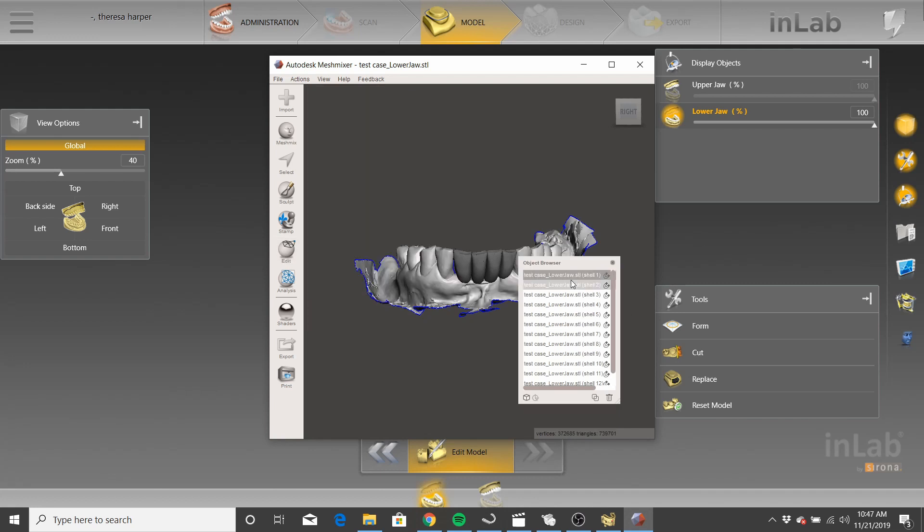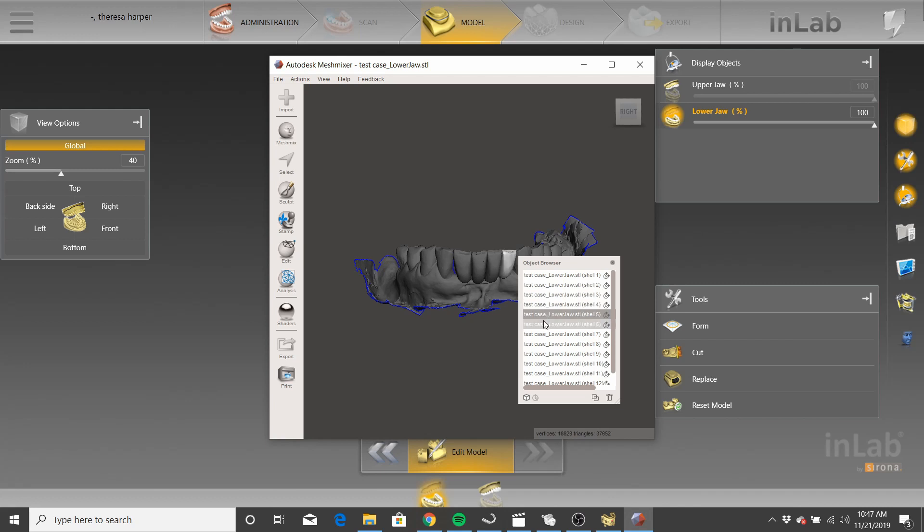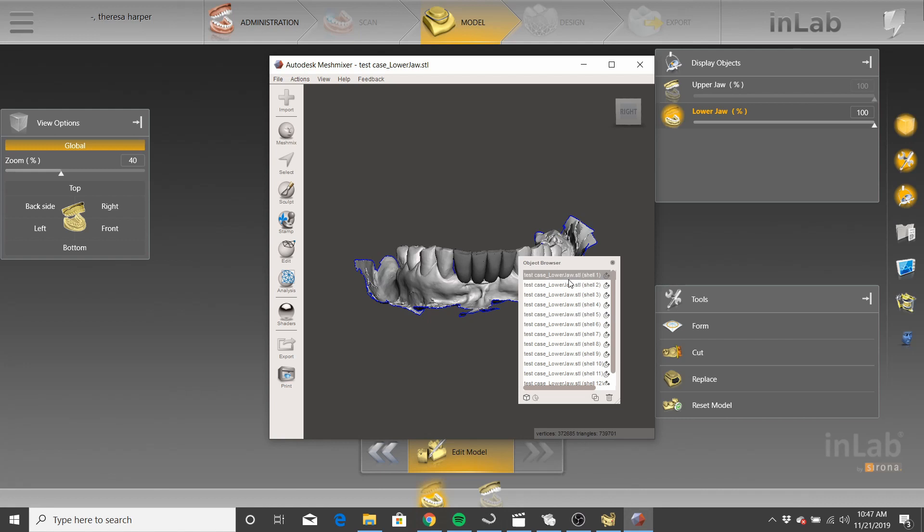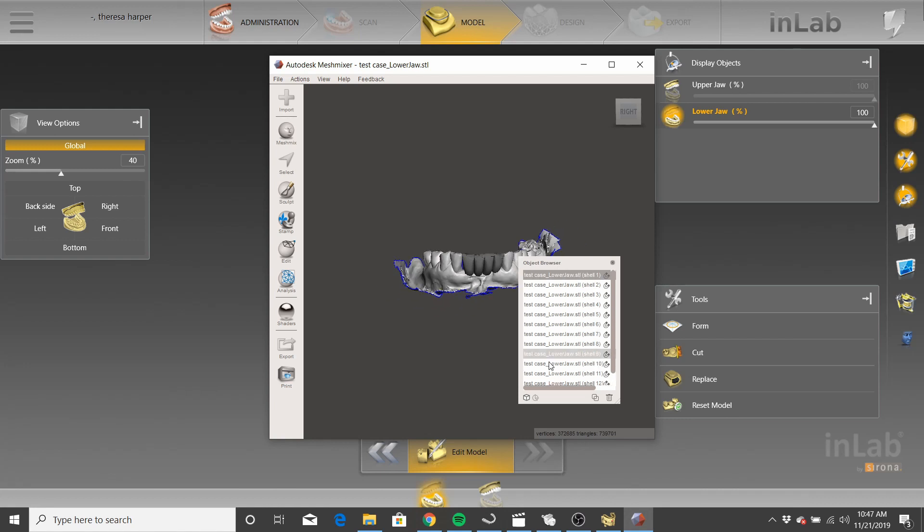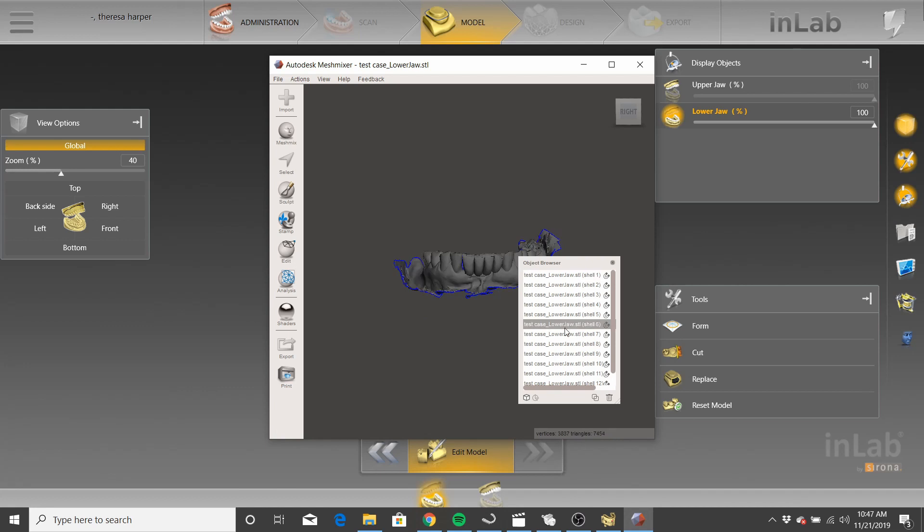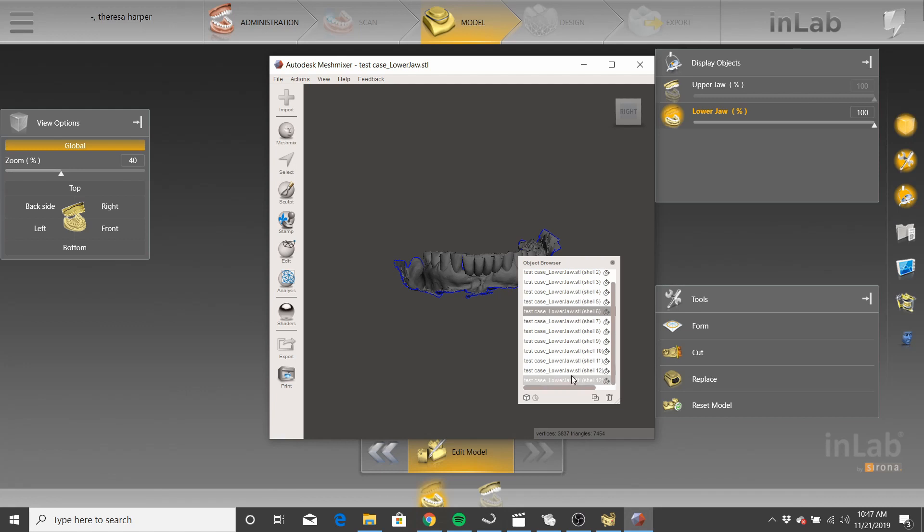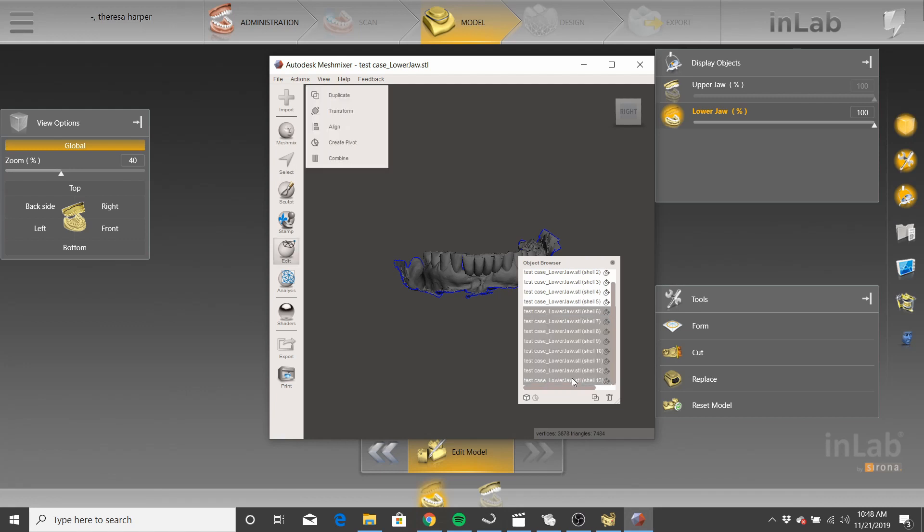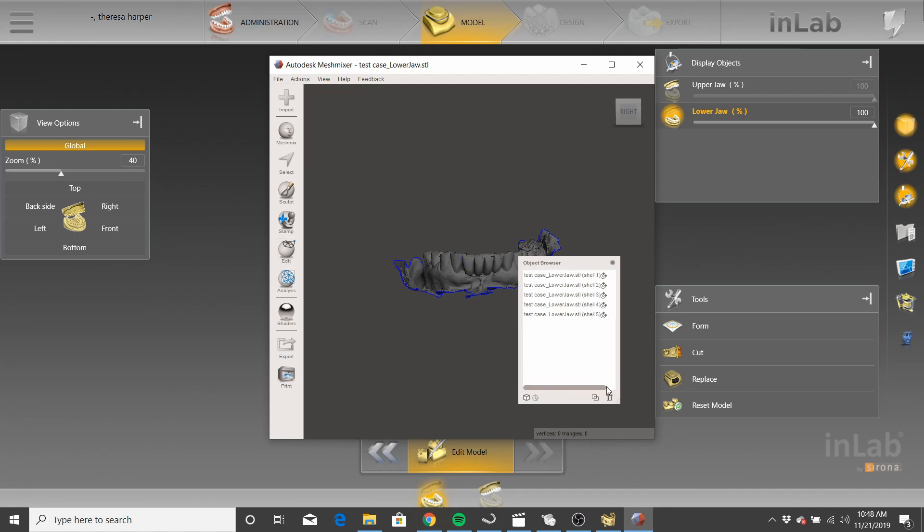You can see all these shells. Shell one is the upper jaw. Shell two is pontic, pontic, pontic, pontic. So these are all individual shells or individual STL files, if you will. Now, when you virtually seat crowns, you just have one shell. So to make these one shell, let's first disregard what we're not going to use. So we'll just disregard six through thirteen, because sometimes you get these extra shells. We're going to delete those.